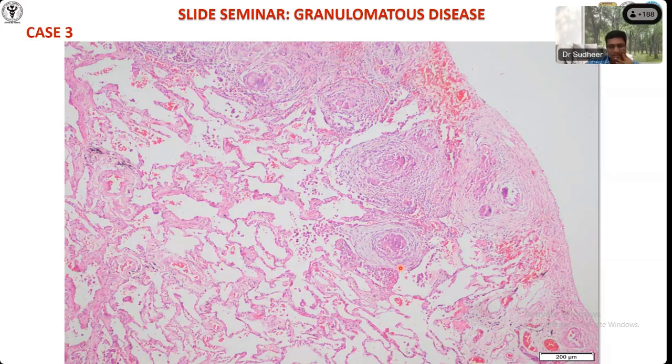And, sir, in the next slide. No, I'm not going to next slide. Tell in this slide only. Sir, they are naked granulomas, sir, without the lymphocytic collar. Okay. Yes, sir, surrounded by fibrosis, sir. A lot of fibrosis. There is a lamellated fibrosis, right? Do you want to comment on anything other than this at this magnification?